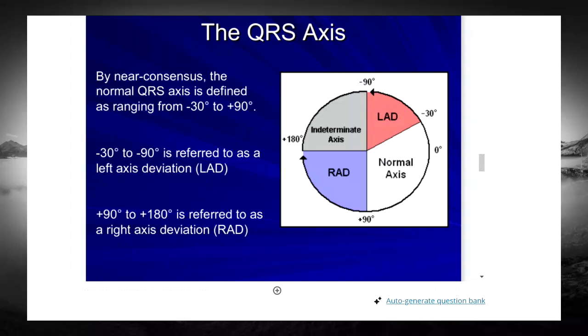Now, there are obviously, as we get further and further along in understanding how to read ECGs, you can directly pinpoint exactly what it is. But you're going to use more towards the equiphasic range to do that than you would with just your thumbs, because your thumbs are giving you a range. Your equiphasic is giving you closer to the exact axis that is needed. You all don't need to know the exact axis that is needed right now, but you will, especially the further you get into clinical things.